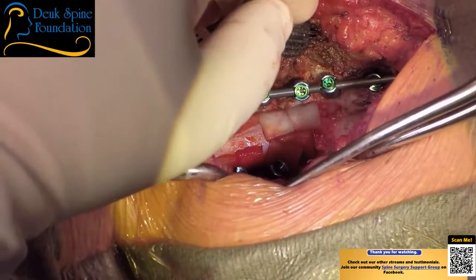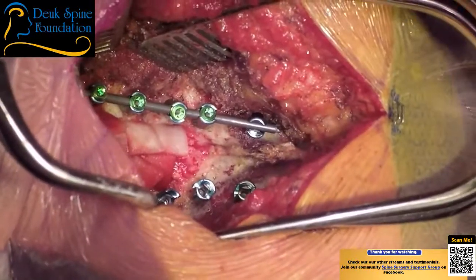You don't want to cross-thread your screws. We got one more to go and we're done.